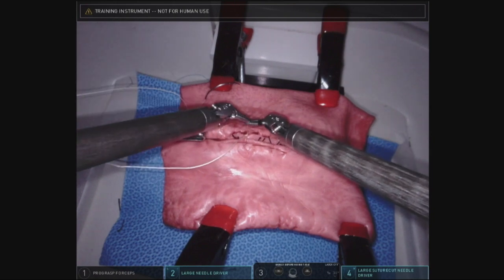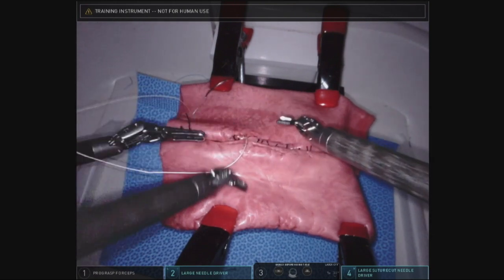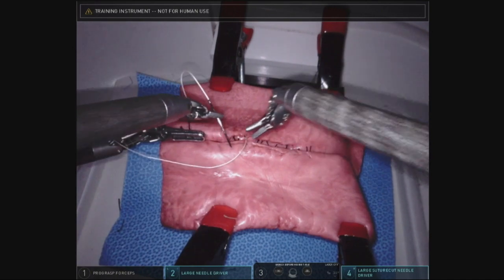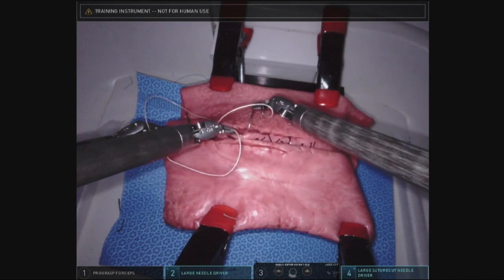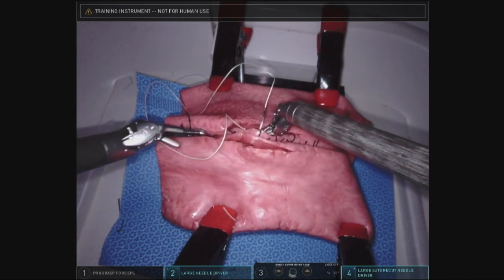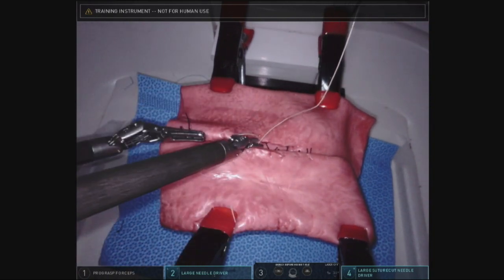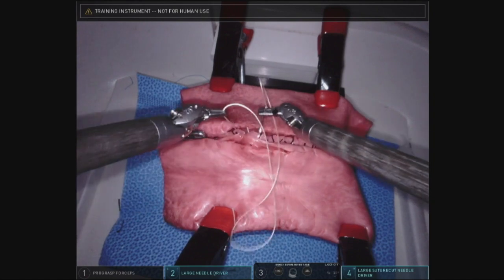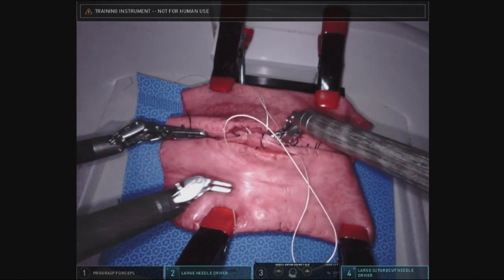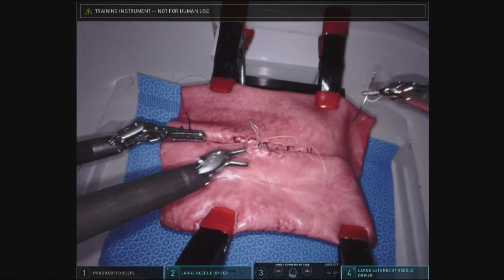Once you've tied your knot, cut the short end off and you're going to run the rest of the stitch on the back wall. Please make sure you get good bites of both walls. If you pull on the stitch, it will elevate those walls anteriorly, making it easier for you to throw your stitches. So just keep going, working towards the corner.